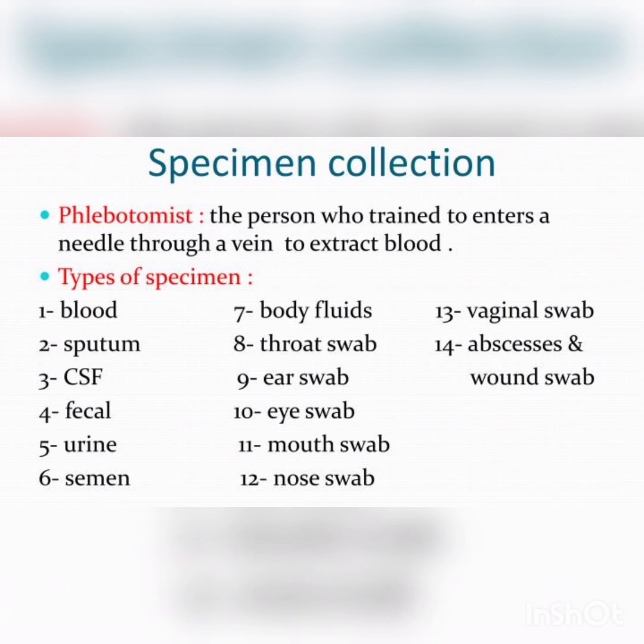You will remove complete oxygen and there will be nitrogen and carbon dioxide, and there will not be any oxygen in that test tube. There will be a tight stopper, meaning a closure. You will close that opening of the tube. So that is about anaerobic culture. A double stoppered collection tube needs to be used for anaerobic culture.